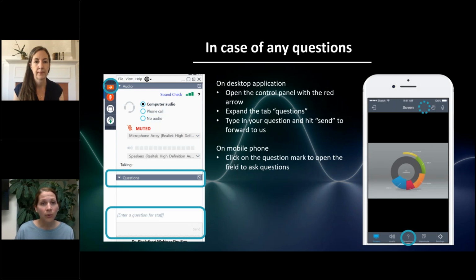Thank you. Next question: is there any reason for the dark adaptation time of 3 minutes? So we did actually do an experiment. In the official electrophysiology world, you want to dark adapt for at least 30 minutes clinically, and purists would probably argue that it should really be longer in order to fully achieve that. Again, from a clinical perspective, that's simply not practical. And so for the pupillometry, we did an experiment where we compared 10 minutes, 3 minutes, and 1 minute of dark adaptation, looking at the transient response. And we found that with 10 minutes of dark adaptation and 3 minutes, we got the same transient response. And with 1 minute of dark adaptation, that was a little bit less. So on that basis, we went with the 3 minutes. There are other investigators who have done portable pupillometry, using different devices, who have come up with similar protocols. So we thought we were in good company there as well.